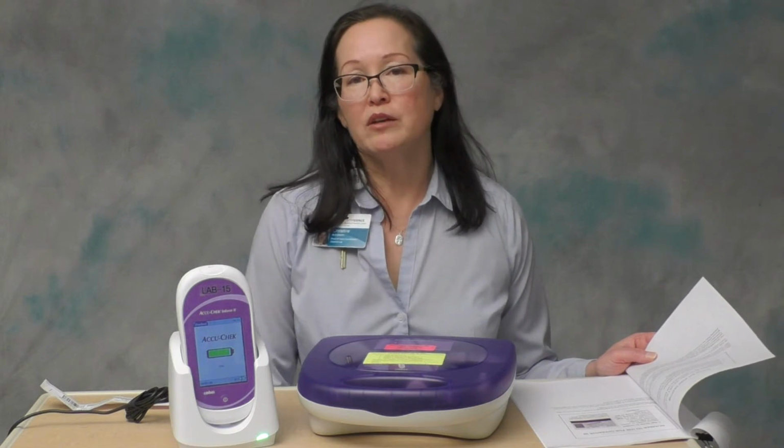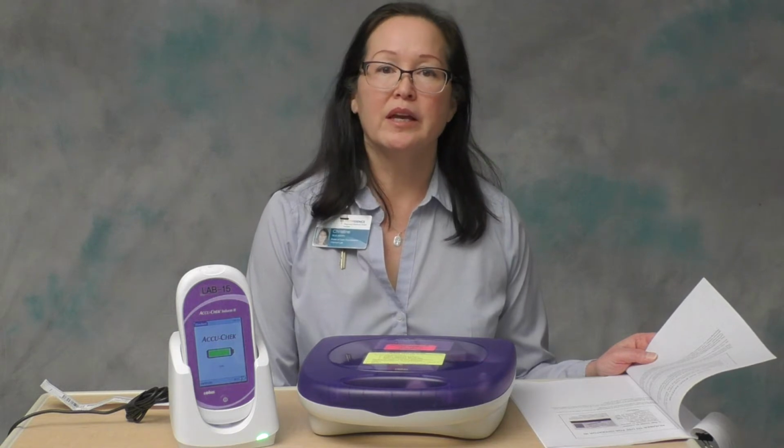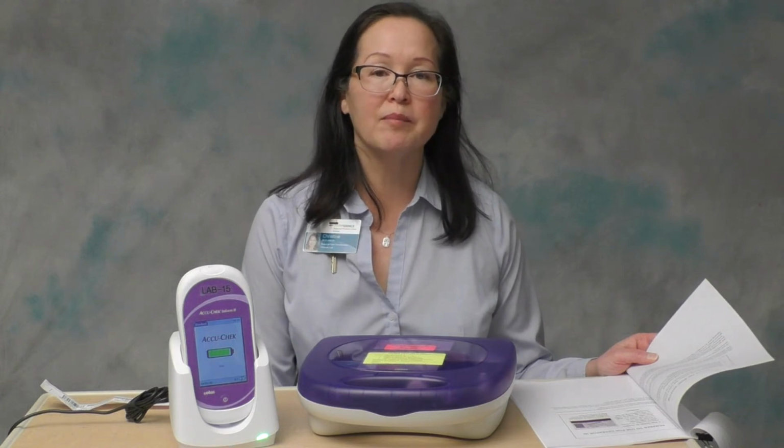In addition to your annual competency, all departments have to participate satisfactorily in proficiency testing. What this means is about 3 times a year we'll come around to the nursing units with unknown samples.